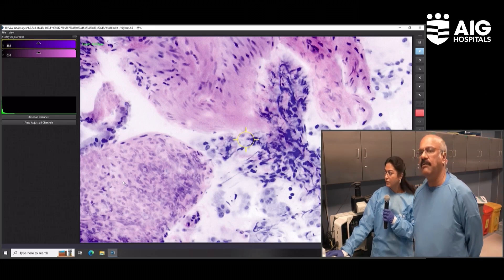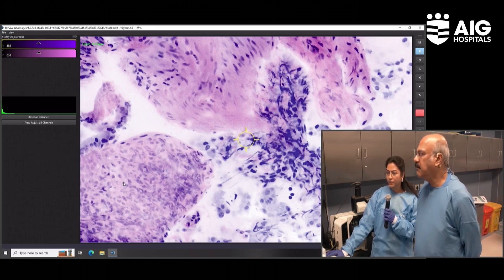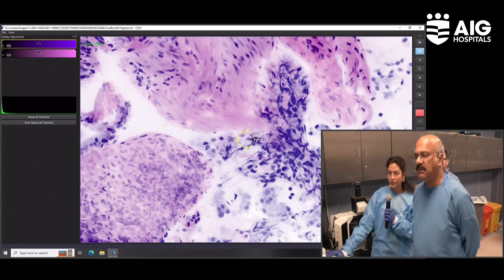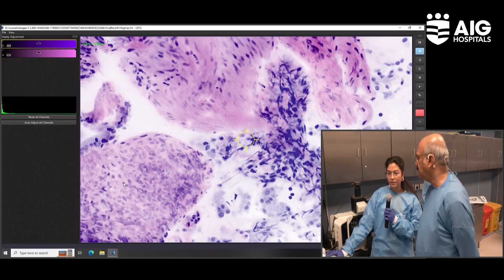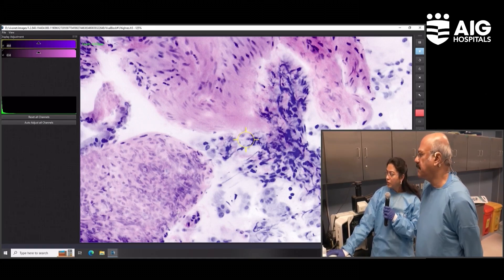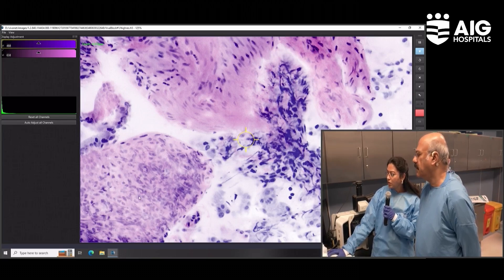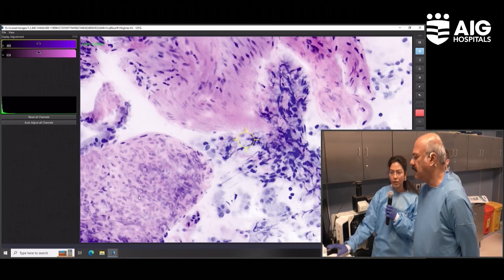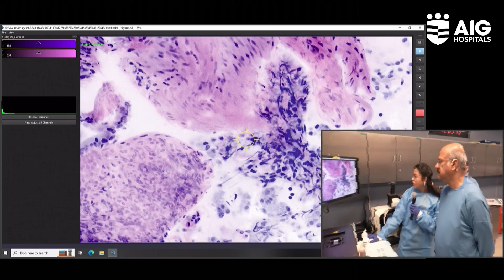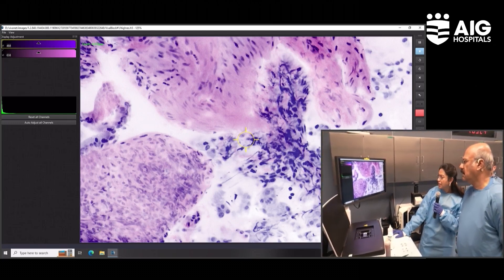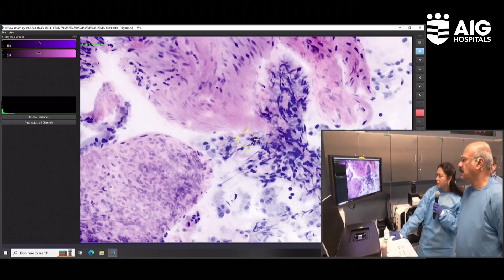We can get an immunohistochemistry to tell us whether it's NET and what grade of NET it is — whether it's grade one, two, or higher. Even from the morphology, we don't have that much pleomorphism or mitosis, so probably it is a lower grade. Even in this figure, you can very well see the normal epithelium, the spindle muscle cells, and these nests of cells — all of these in one image.